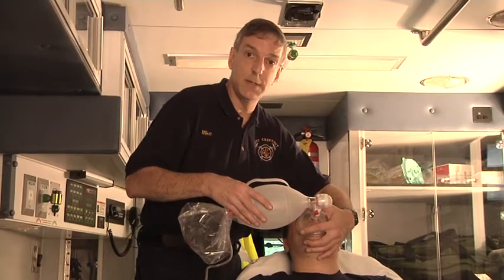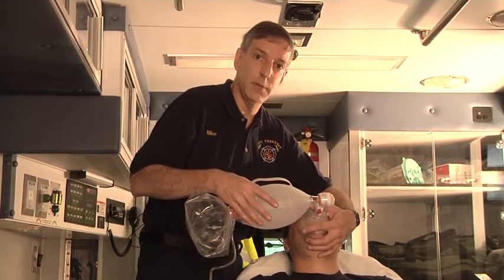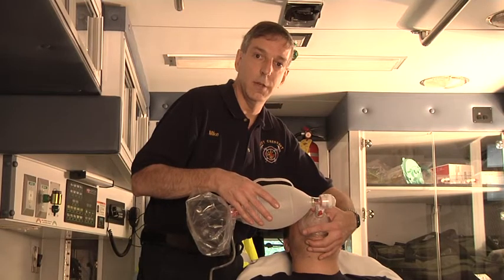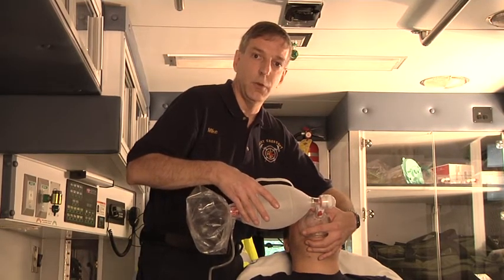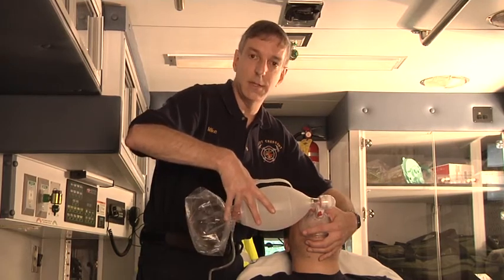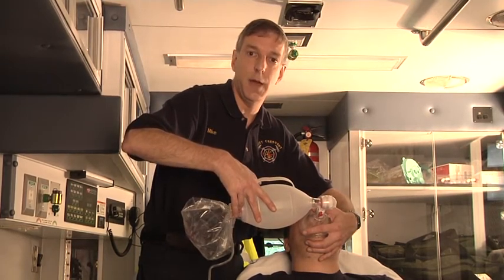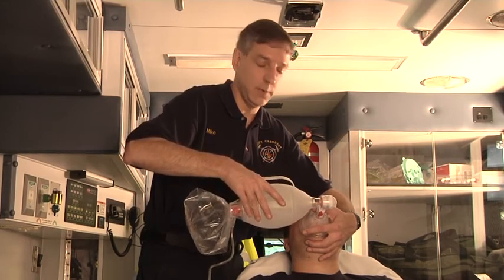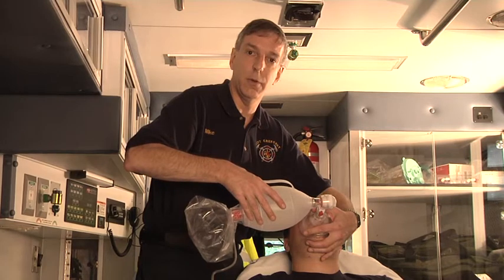For someone who's spontaneously breathing, there's a challenge in that you need to coordinate your ventilations with the patient's respirations. In this patient, we can actually see some denting of the bag as the patient breathes in and out. Our next goal is to try to track the respirations of the patient so that we're breathing for him.